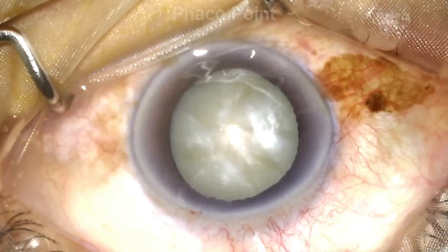I'd like to demonstrate this in a patient with an intumescent soft cataract who underwent phacoemulsification with the direct chop technique. Let's now watch this video.